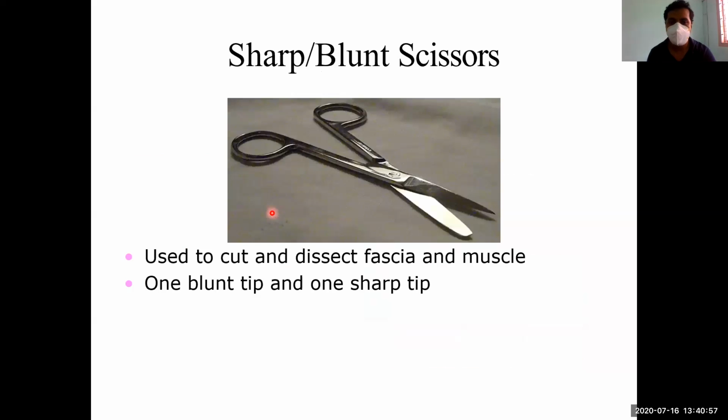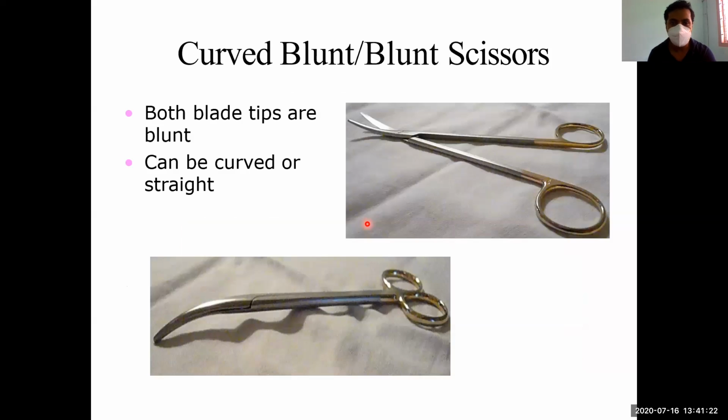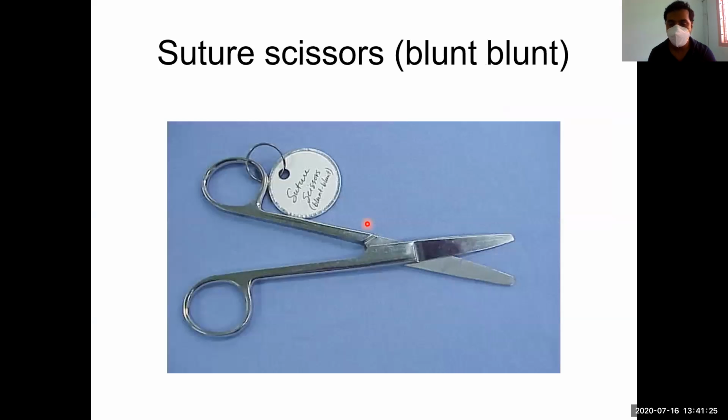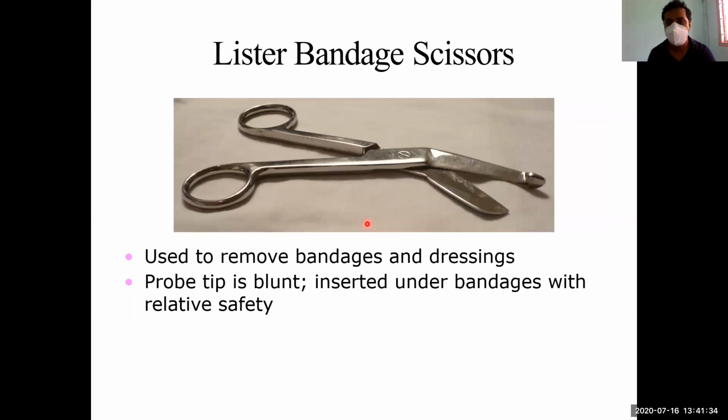And the scissors, various kinds of scissors, depending upon which structure we have to cut, and whether it is superficial or deep, or whether we have suture cutting or tissue cutting. There are various types: straight scissor, curved scissor, one end sharp and one end blunt, both ends pointed, the curved one, blunt scissor, and both ends blunt. The Mayo special kind of scissor, the Mayo dissecting, and the Metzenbaum scissors. Next is the bandage scissor. There is a special type of scissor which is used to remove the bandages. The special thing to be noticed is the tip.